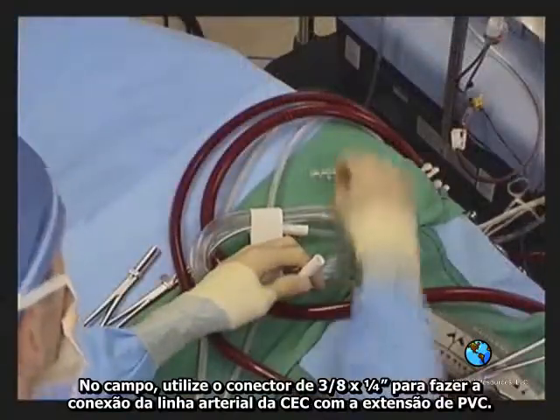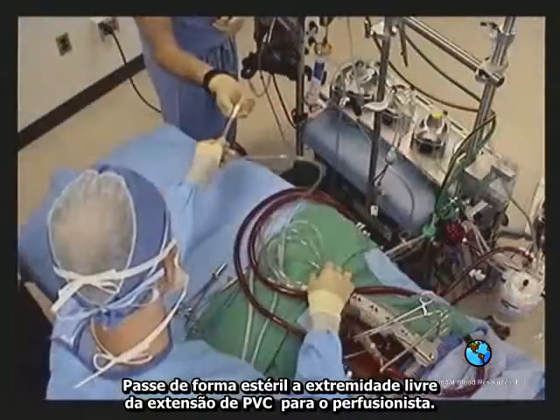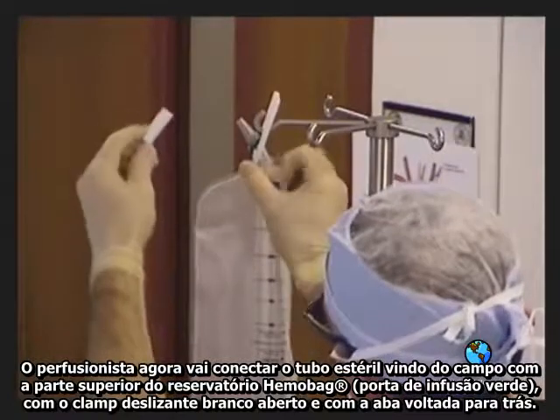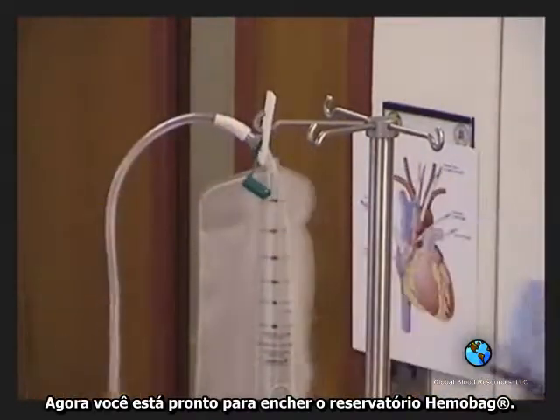In the field, have them place the 1/4-inch end of the connector onto the tubing and hand off sterilely the other end to the perfusionist. The perfusionist will now connect the sterile tubing from the field to the top of the hemobag at the green infusion port with the white master slide clip open and the slit facing back. You are now ready for filling.